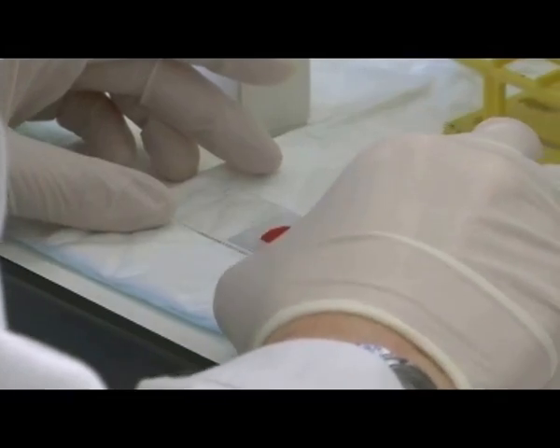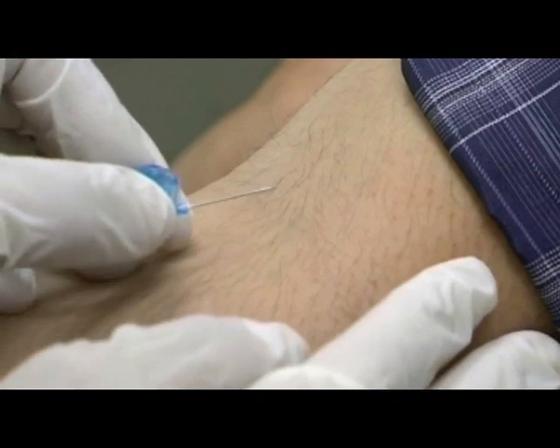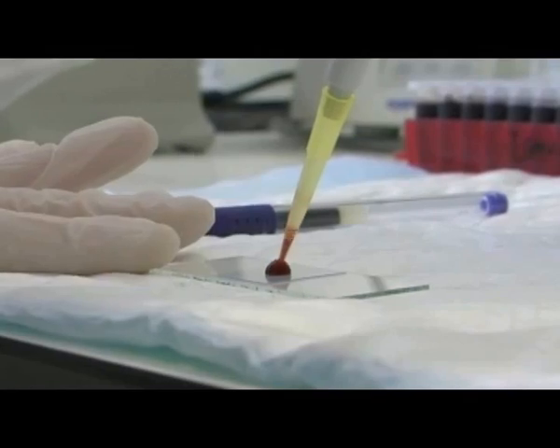Hemoglobin level is a key parameter used throughout the hospital for detecting hemorrhage and anemia. However, current methods are invasive, time-consuming, and cumbersome.